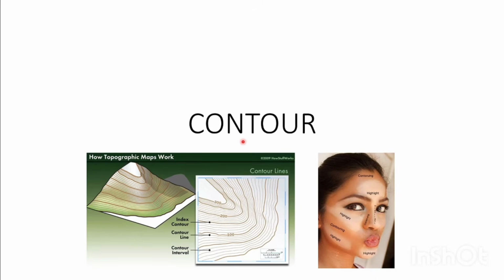Next is contour. This is also a soft setting we can change. Contour generally means the border.